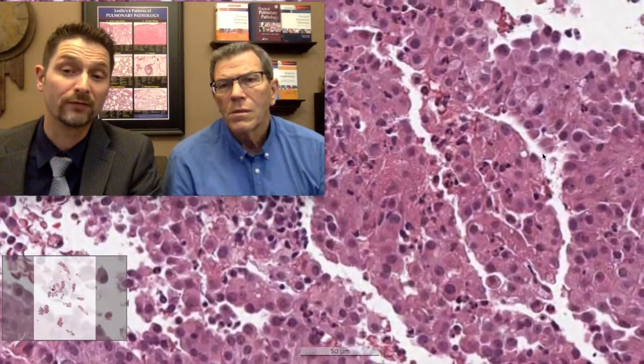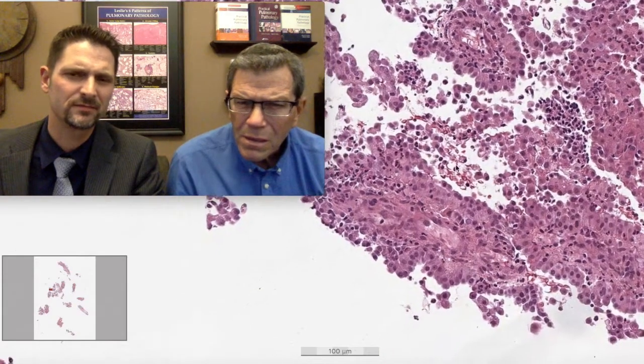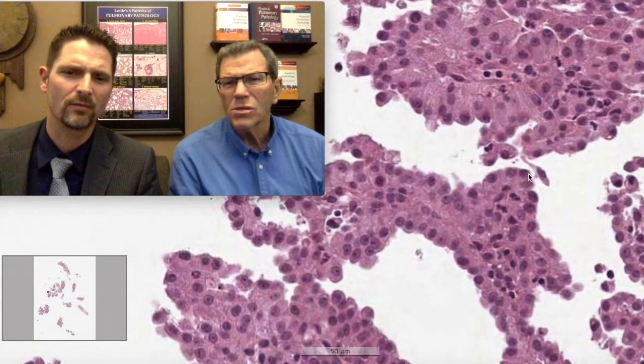But we've got this robust proliferation. A cellular process that's not quite blue, is it? It's epithelioid. Kind of a pink epithelioid. These cells are nice and plump. This almost looks like a fibrovascular core. And we've got these plump epithelioid cells that are kind of monotonous. They have a little pinpoint nucleolus. They're discohesive. Not like frankly malignant. At least not here. Not 100% malignant. Here's some more of these fibrovascular cores.